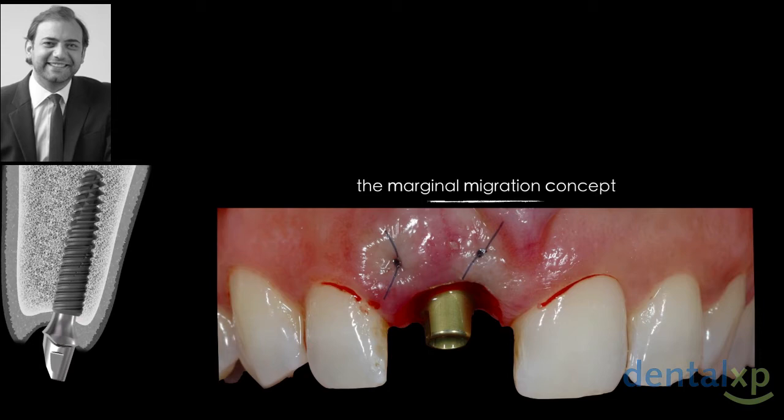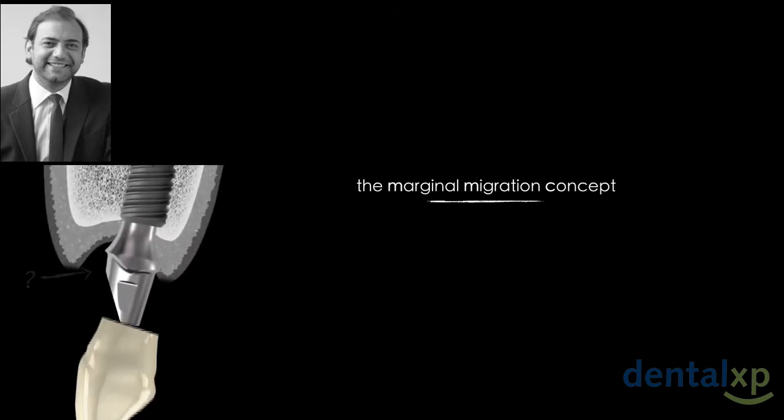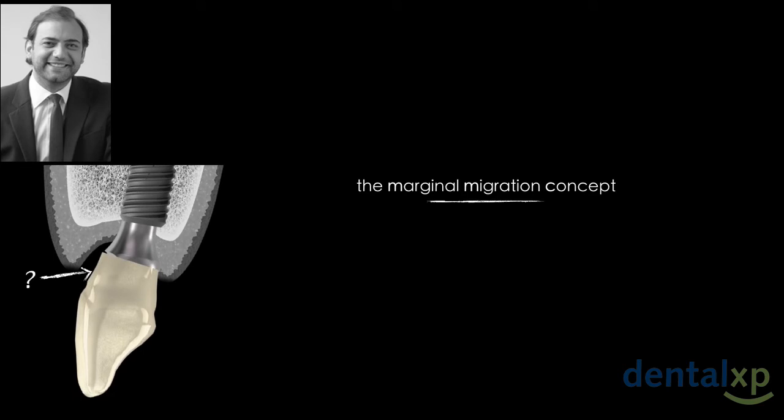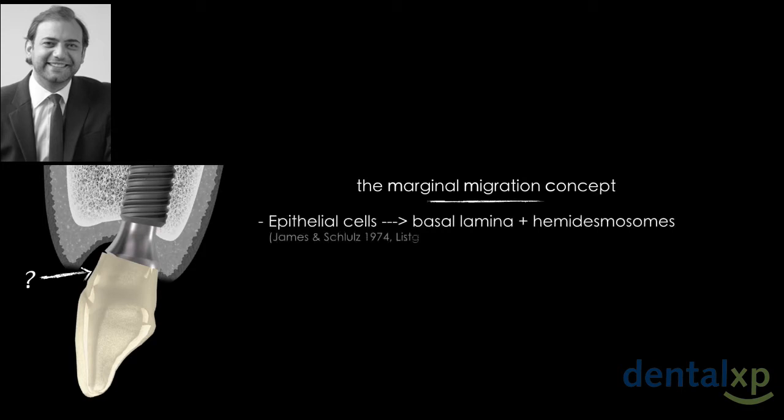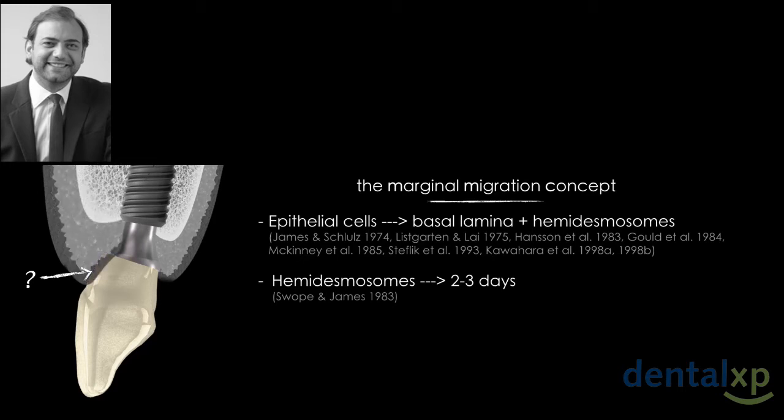So what we worry about, actually, after performing this type of surgery, is the mid-facial margin. This is our worry, and this is where we need to have success in these surgeries. So what do we know about this area? We know that epithelial cells, I won't tire you with this, will migrate, and we will have a so-called attachment. It's not actually an attachment, it's very weak. This can already occur 2 to 3 days after surgery. So what we expect to see is this.